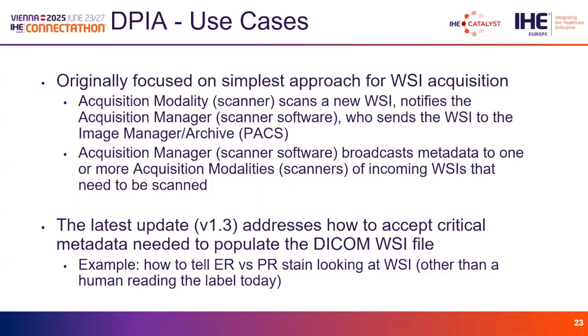The latest update identified a significant gap in not being able to communicate metadata related to the actual stain that's on the whole slide image, as well as numerous errata that have been addressed thanks to input from the community, which is greatly appreciated. Next slide.